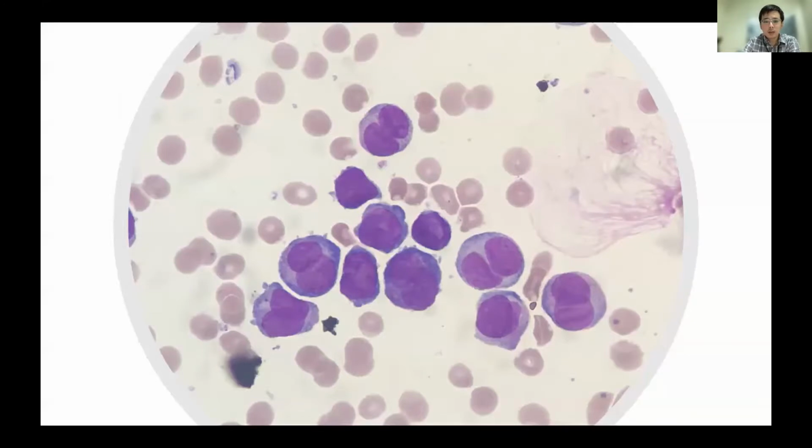So this is just a case to show you that APML does not really need a faggot cell to call it an APML. And with the morphology of this hypogranular variant, you can actually kind of predict the immunophenotype aberrancy, and also the type of translocation 15;17, or the PML-RARA isoform, by their morphology as well.